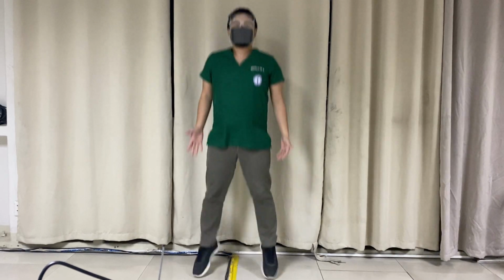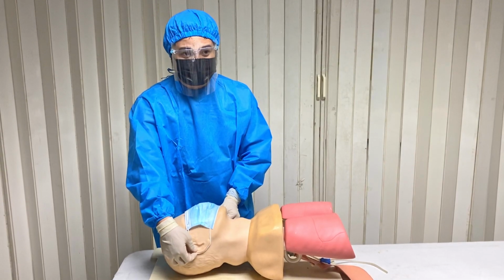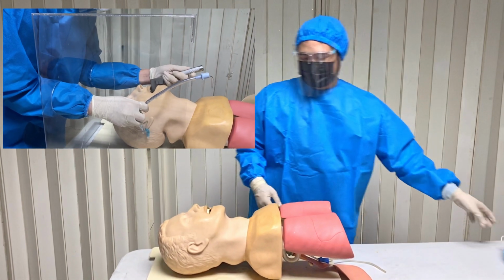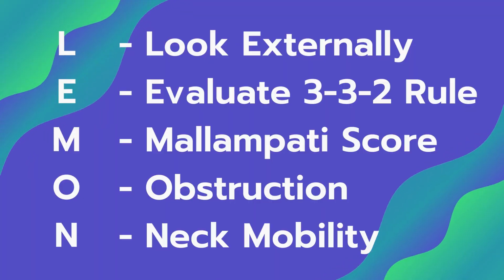Don complete PPE. Remove mask from patient if present. A glass shield may or may not be used depending on institutional protocols. In assessment, remember the mnemonic LEMON.